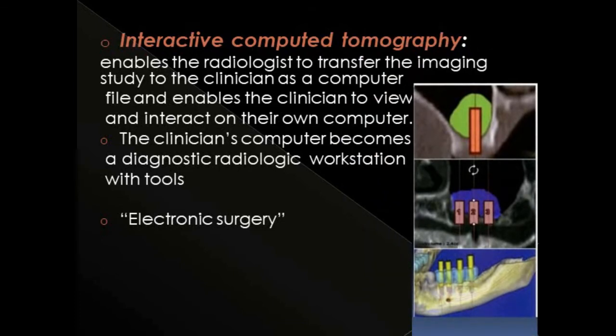Another characteristic feature of ICT is that the radiologist as well as the clinician can perform electronic surgery, that is by selecting and placing arbitrary size cylinders that simulates the root form implants, and they can perform the electronic surgery as you can see in the picture. So this is interactive computer tomography. So we have discussed three advances of CBCT, that is a microtomography, multi-slice helical CT, and the interactive computer tomography.